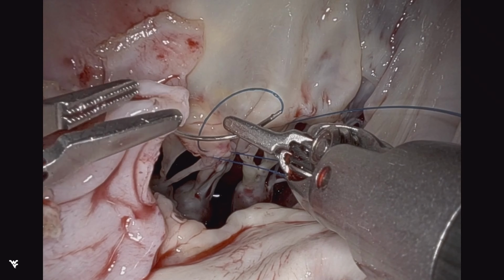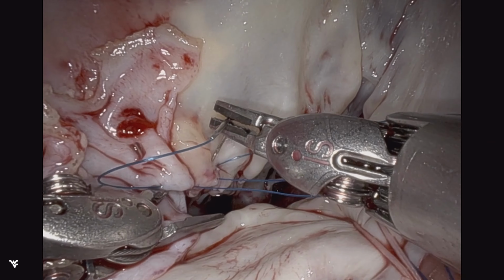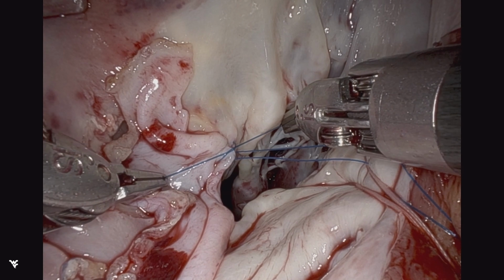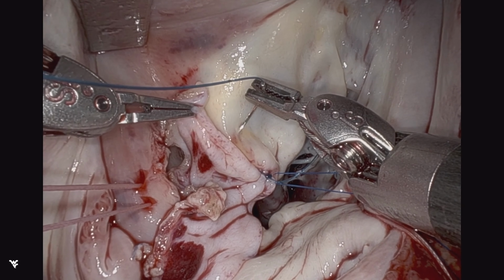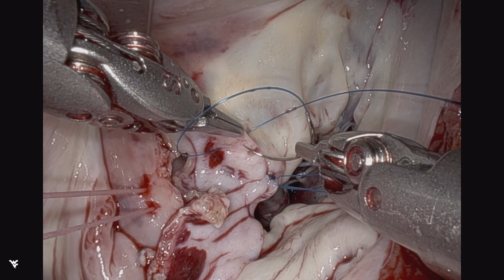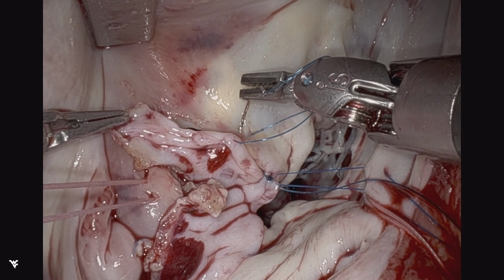And this bridges the anterior leaflet as well as the posterior leaflet, essentially completely replacing the commissure in this case. But as you can imagine, there's a fairly large gap. Unlike the other bridging patch technique cases we have illustrated, the gap at the level of the mitral orifice was rather small, and it allowed for utilization of existing tissues and cords.